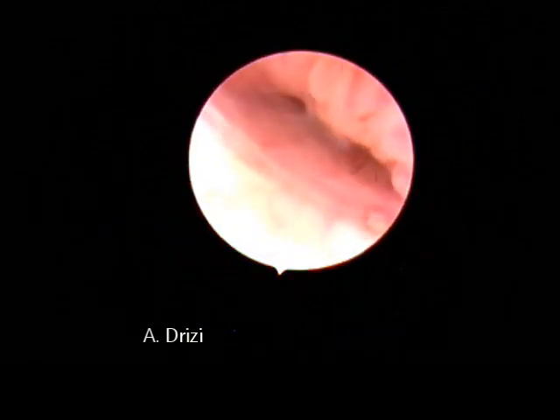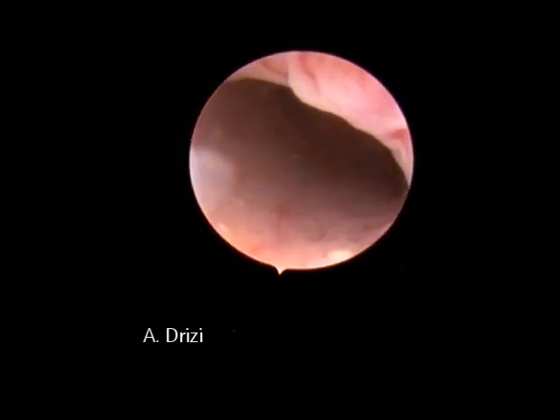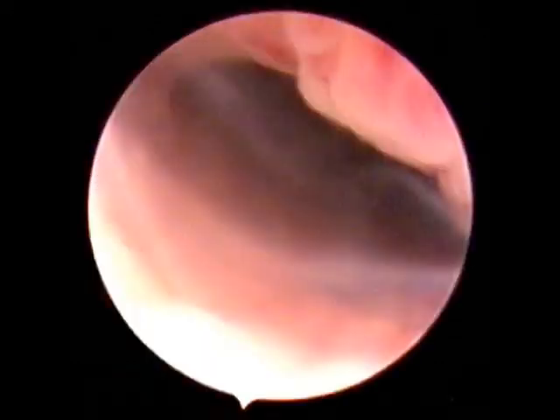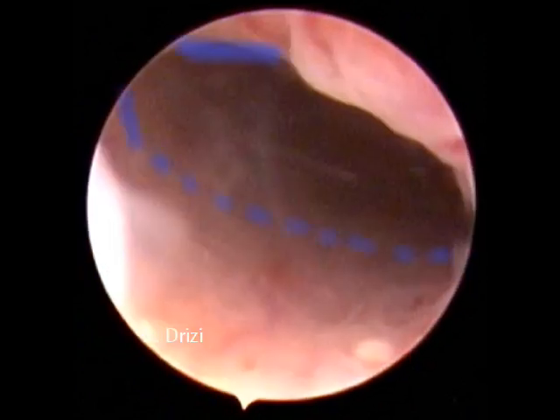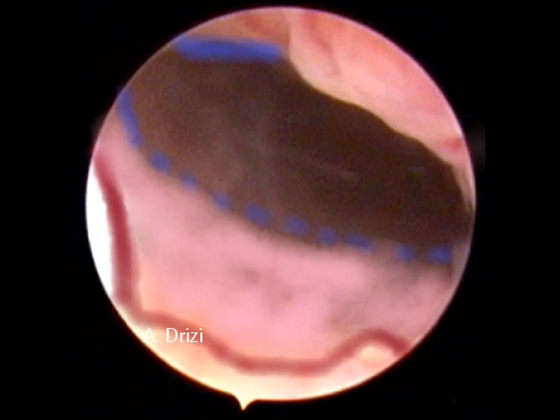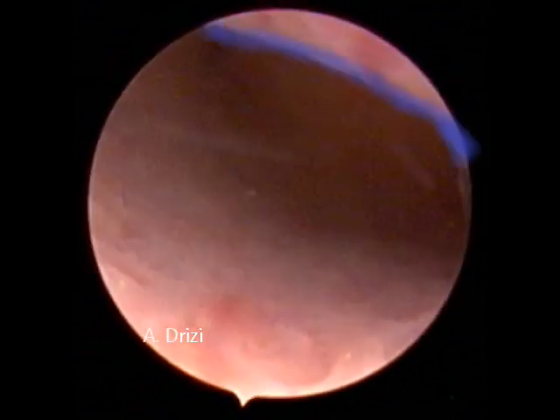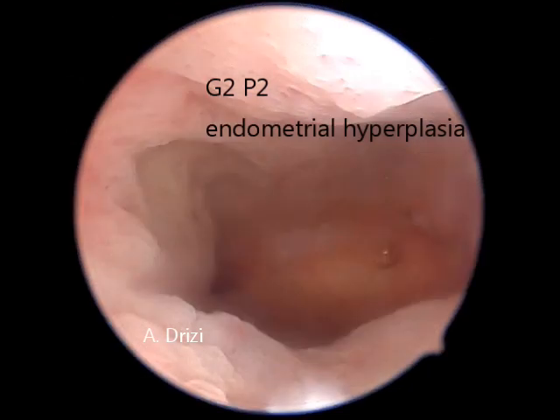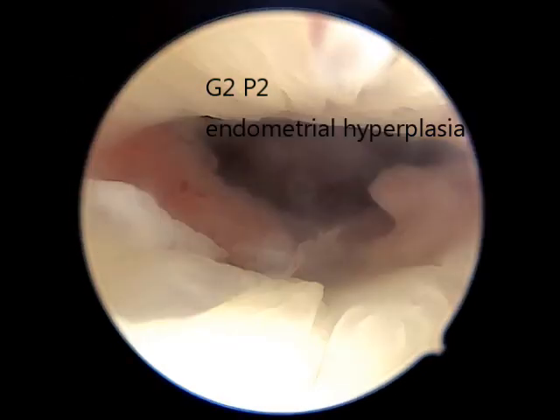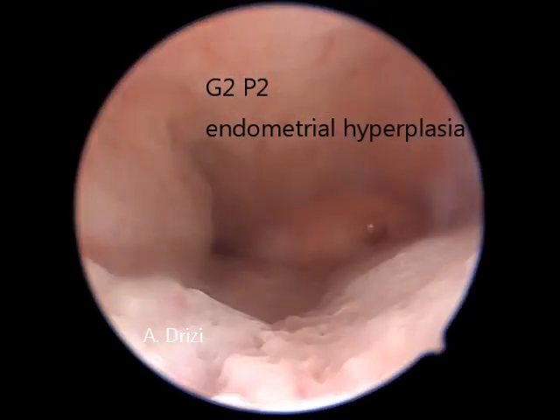Another patient, G2P2 — the anatomical ostium is less visible here; one needs to be more careful. We can identify the anatomical ostium, the histological ostium, and the uterine isthmus between them.